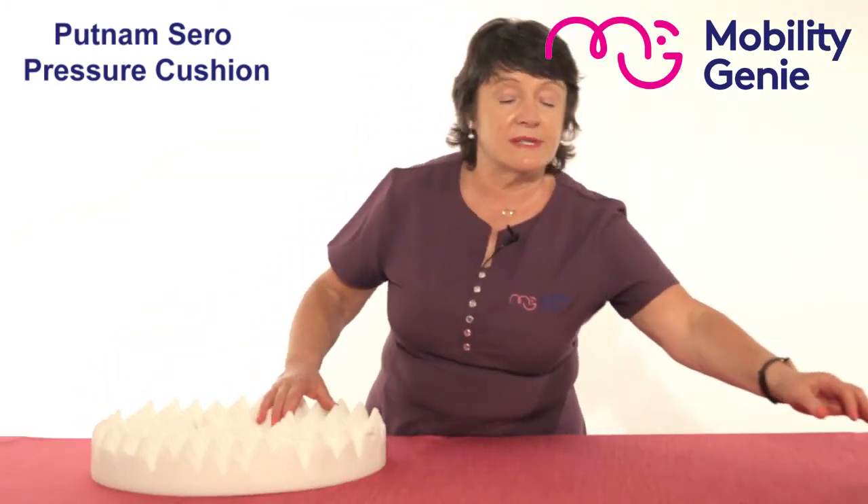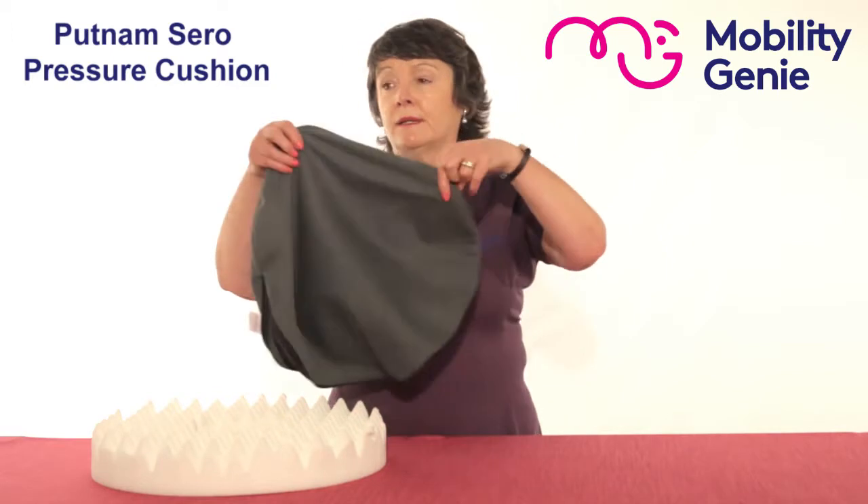This cushion comes with a stretchable washable cover that is zipped at the back.